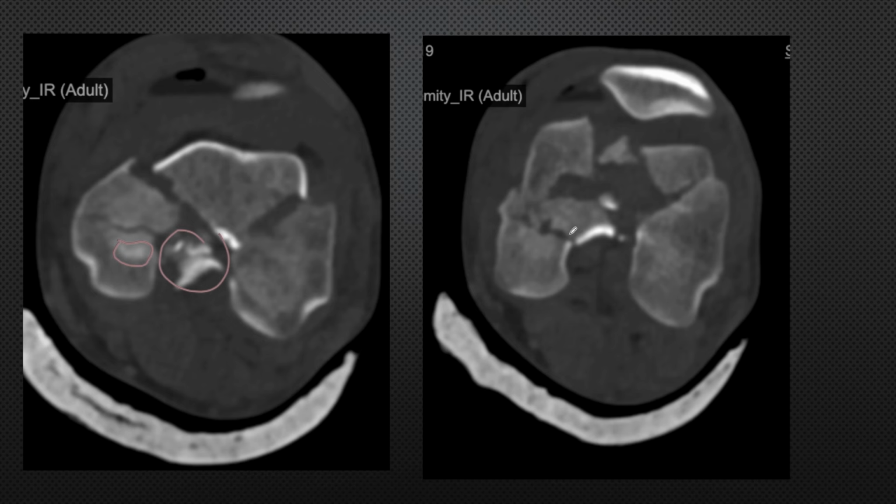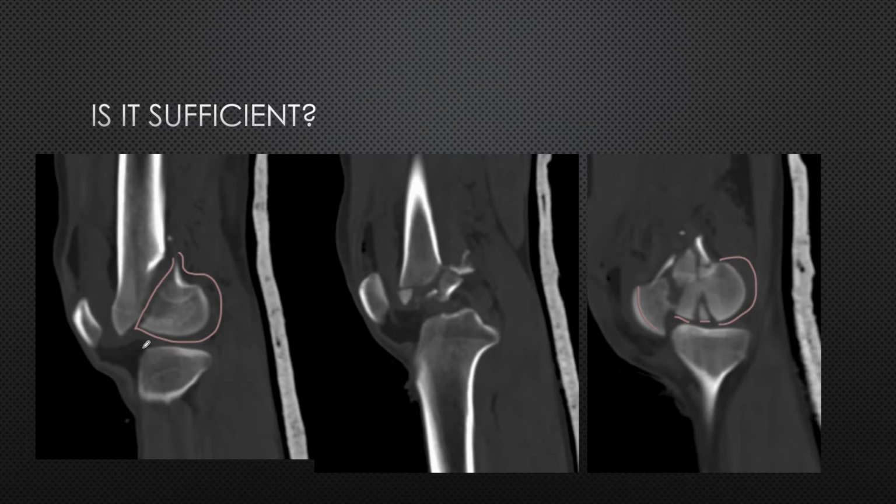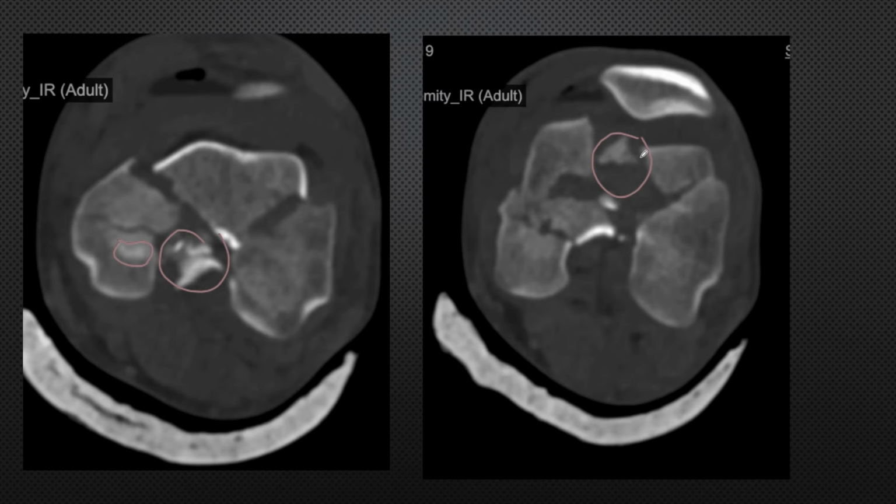And in this cut also we are able to see similar findings, but you see here now we have gone a bit down. Now we are able to see the comminution in the notch part and in the trochlea. We are below the intact fragment of the trochlea. That means we are somewhere here, lower than the part which was intact. So extensive comminution is there in the notch part and on the medial condyle, while there is no comminution on the lateral side.